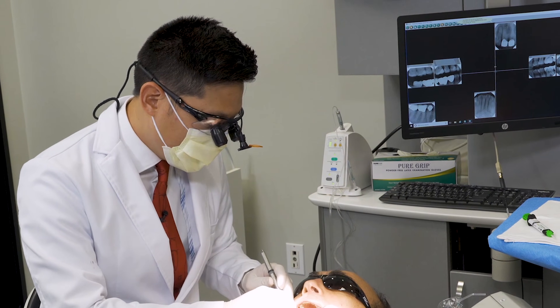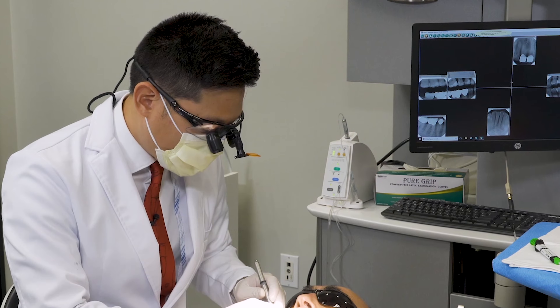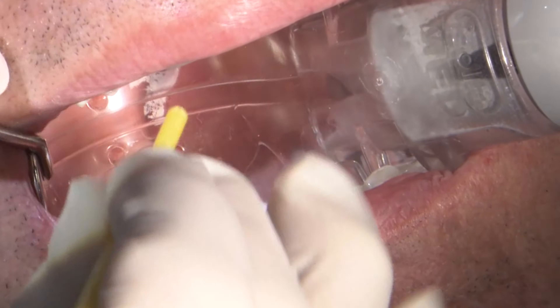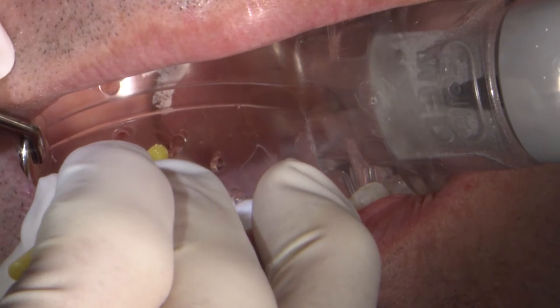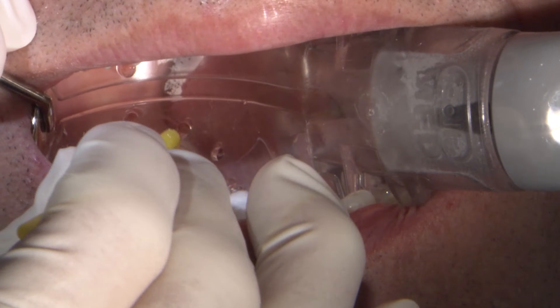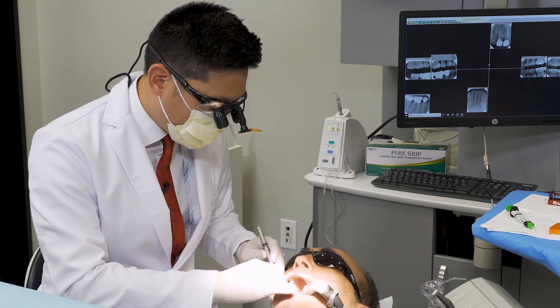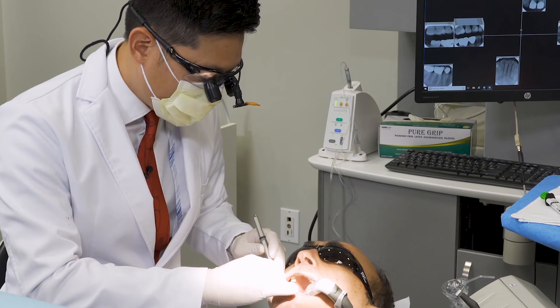Now you do have to be careful — the desensitizing agents could actually be a soft tissue irritant. So I try to keep the solution concentrated just on the preparation. I lightly scrub that into the preparation; it helps the prep just absorb the solution in. I let it sit for about one to two minutes, leave it on, and we actually don't want to rinse it off — I just leave it on the preparation.